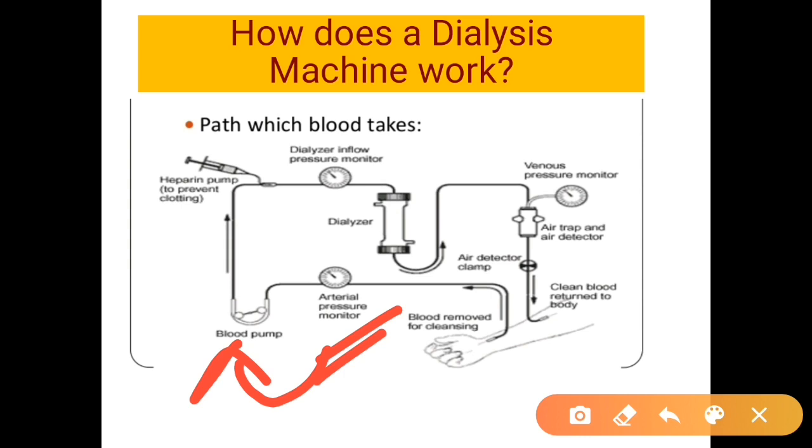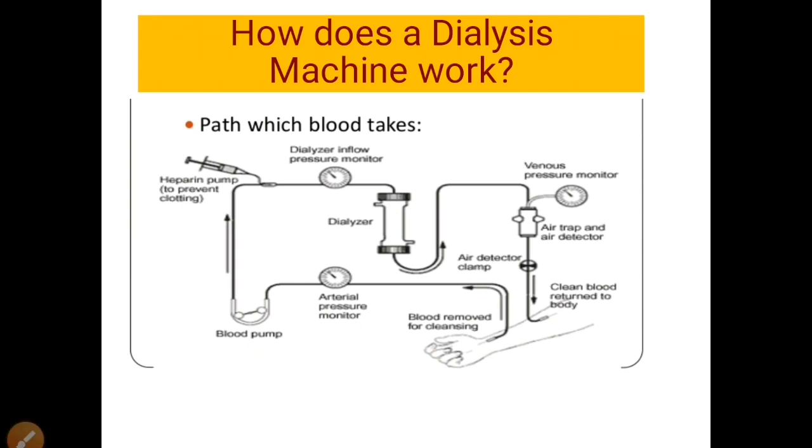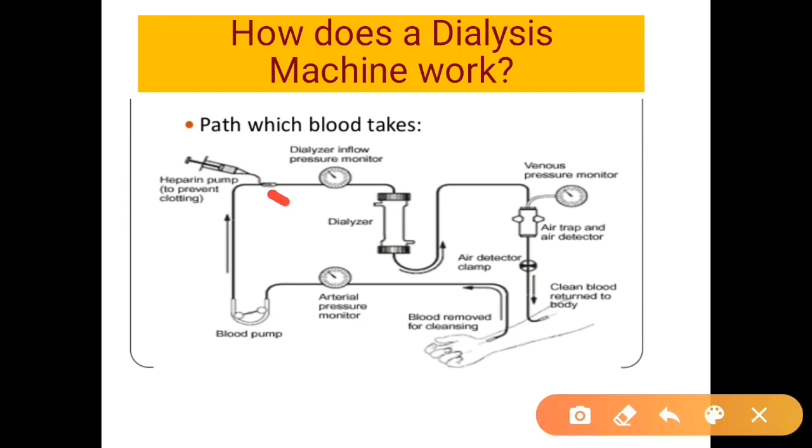And next we can see a heparin pump. Heparin pump means the heparin gets mixed with the blood so that the blood cannot clot. After that we can see a dialyzer inflow pressure monitor. In this section the pressure can be measured before the blood goes to the dialyzer.